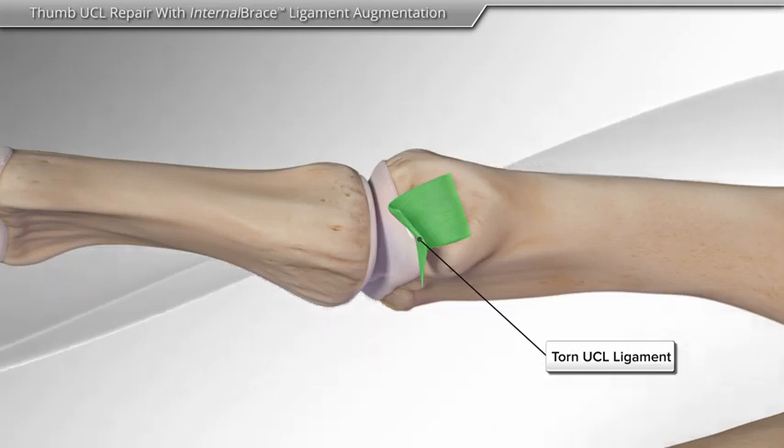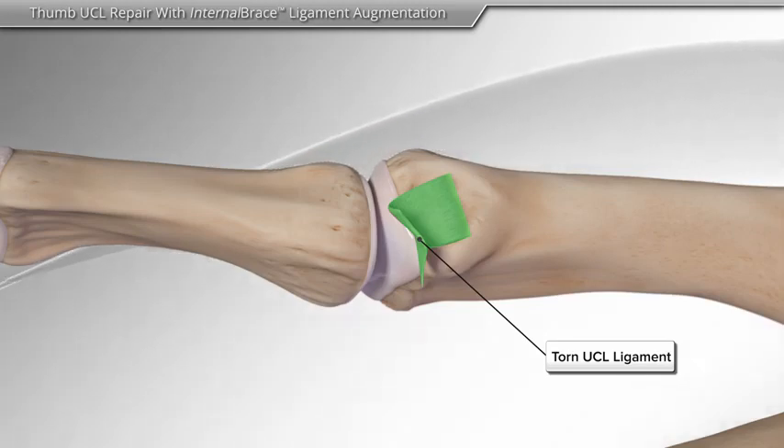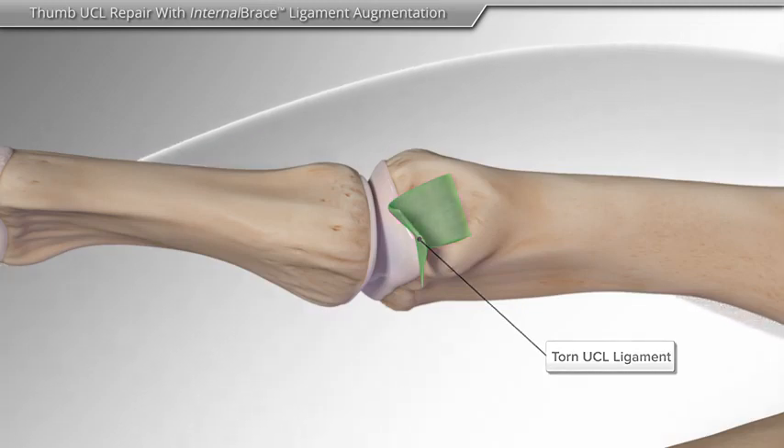In this animation, we will show the repair of the ulnar collateral ligament, or Thumb UCL, with internal brace ligament augmentation using anchors and sutures.